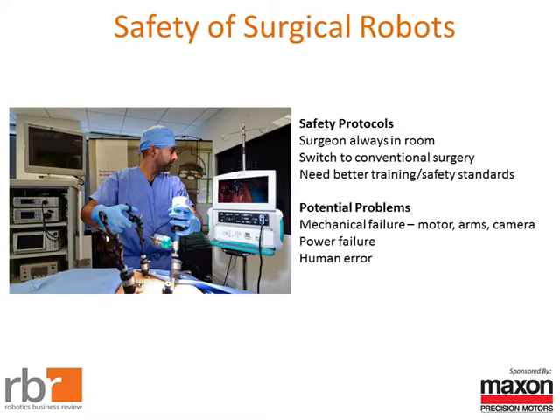Well, what's one of the reasons that it might fail? Well, there's a host of reasons. It's a mechanical system, and mechanical systems break down. Even something as reliable as your washing machine is eventually going to break. So I guess what I would say is, a motor could reach its end of life and stop operating. There could be a power failure.